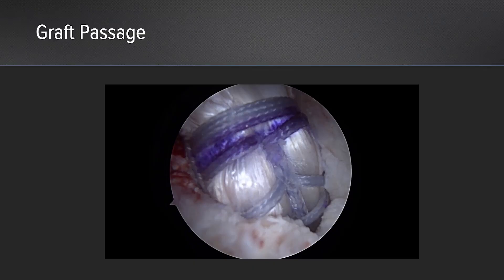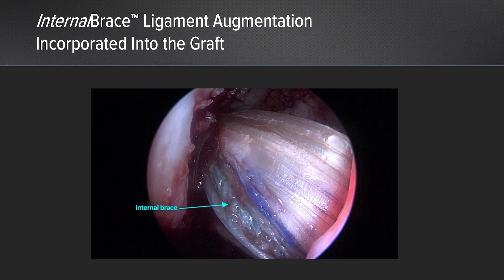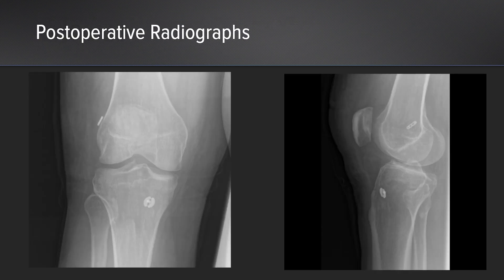Our graft is passed and our internal brace here is visualized on the posterior aspect of the graft. And here are the patient's final post-operative radiographs.